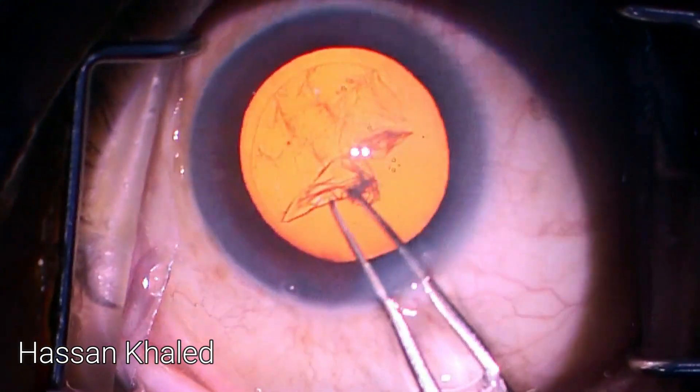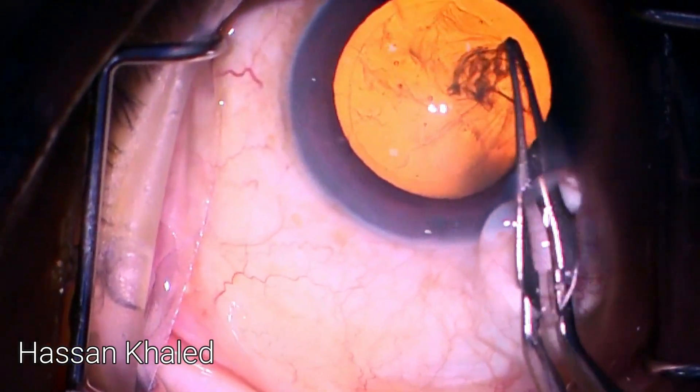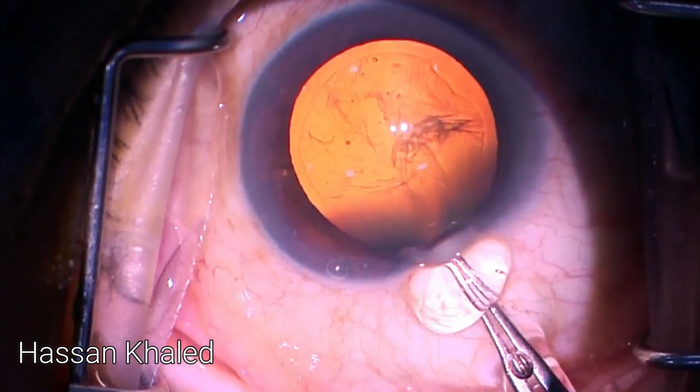Let's watch this case. I started with a 2.4mm clear corneal incision, injected dispersive viscoelastic, then performed the capsulorhexis, which is about 5.5 to 6 millimeters.